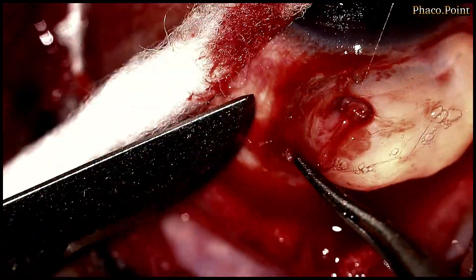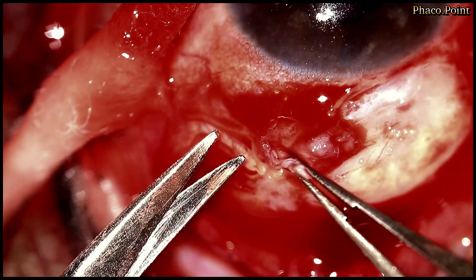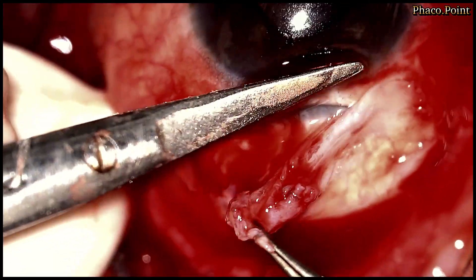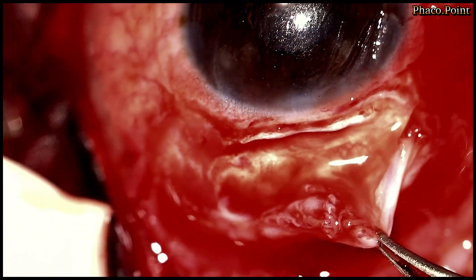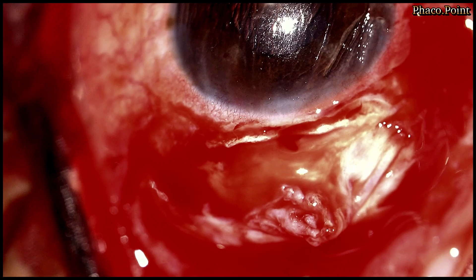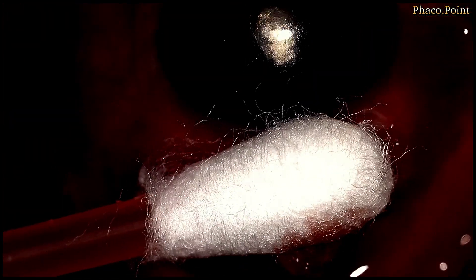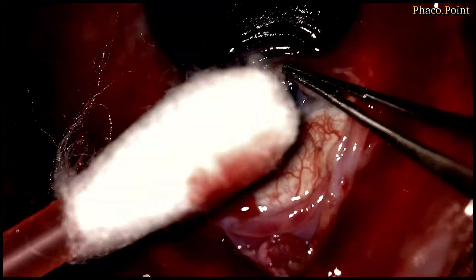At this point you will notice that there is a sudden gush of aqueous. This clearly means this cyst was in continuity via the main SICS tunnel with the anterior chamber. We proceed with the dissection of the cyst, and here is what we can see: there is a completely open main SICS tunnel wound with a continuity with the anterior chamber, and this fistula resulted in the formation of the cyst.